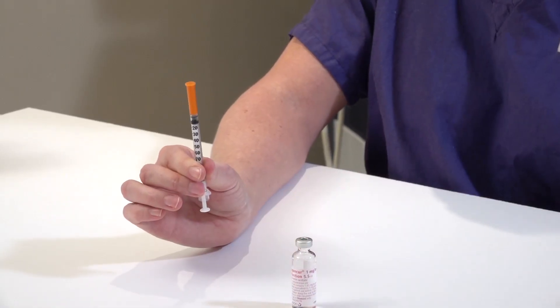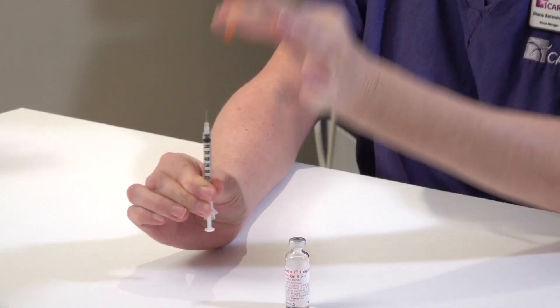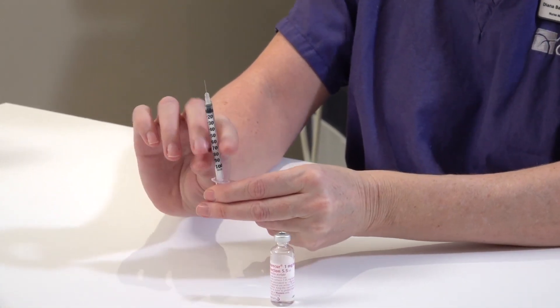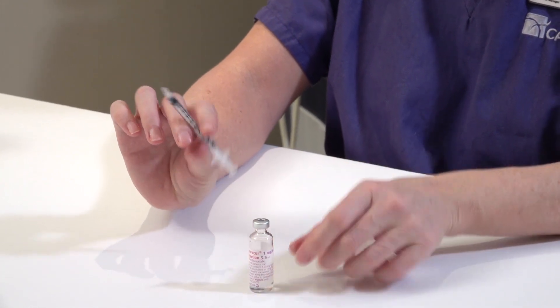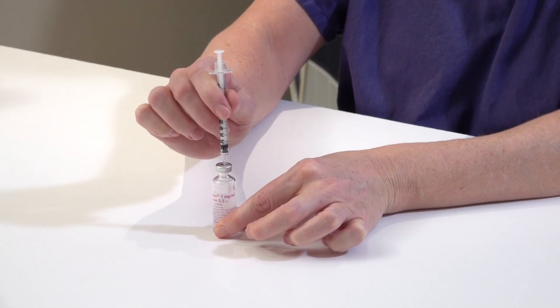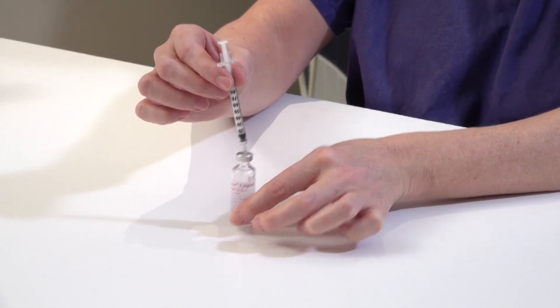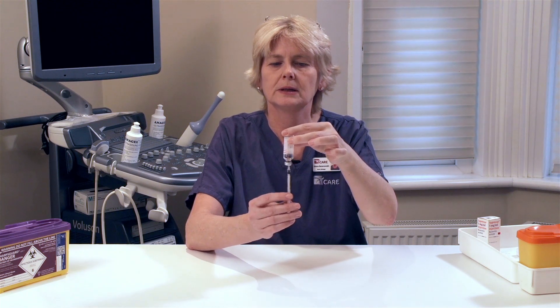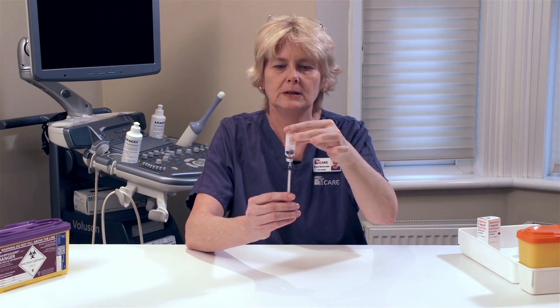Using a 1ml syringe, remove the base cap and remove the needle cap. Insert the needle through the middle of the rubber bung on the top of the ampule. Invert the ampule so that the liquid is now over the tip of the needle.